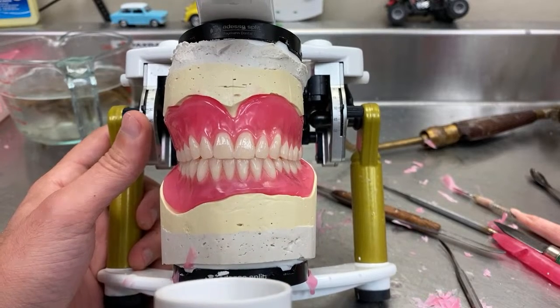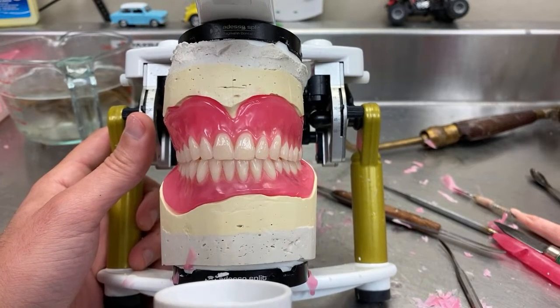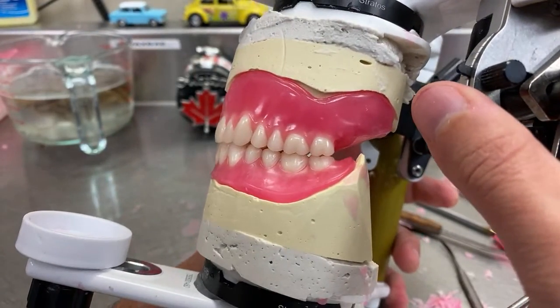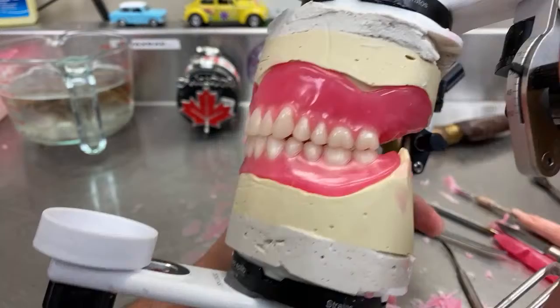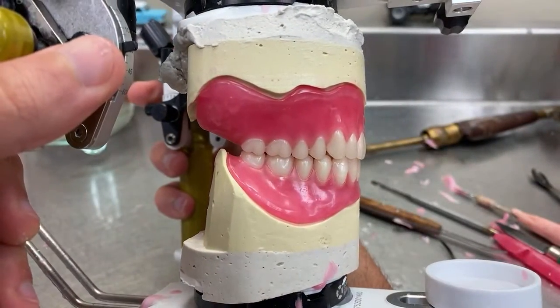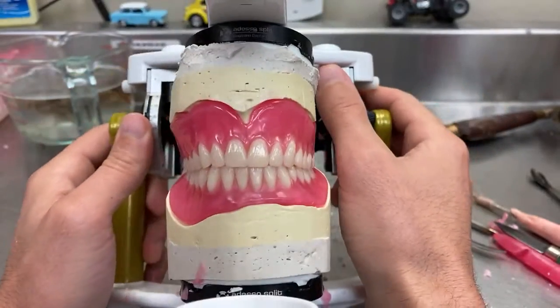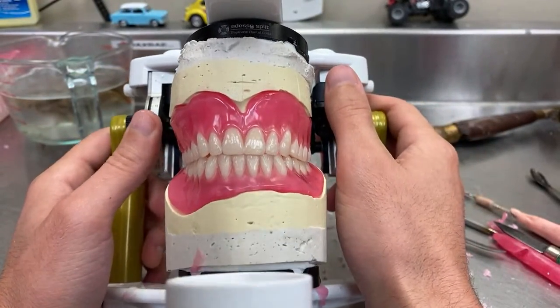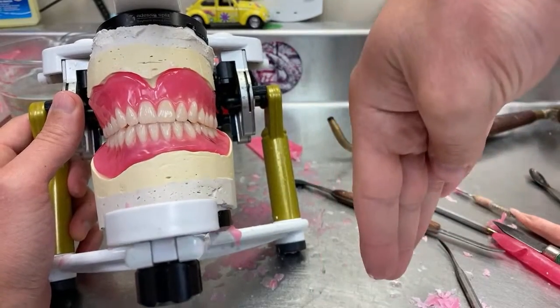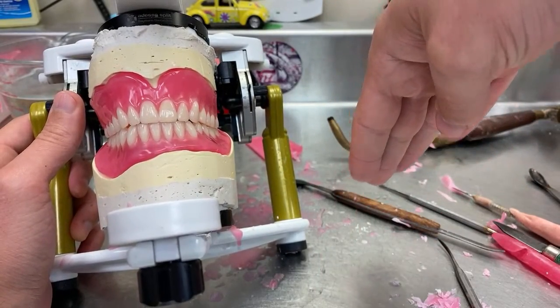Upper centrals upright or tilt? Is upper centrals upright or tilt? What do you think? Based on how much support the patient needs, that's when you decide how to set your centrals. Sometimes I set them straight like that. Sometimes I give them a little bit of flare.